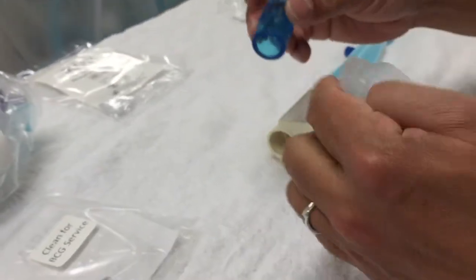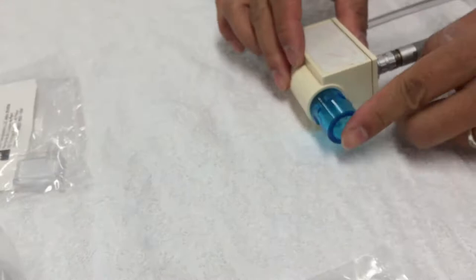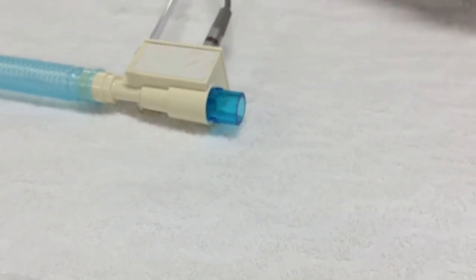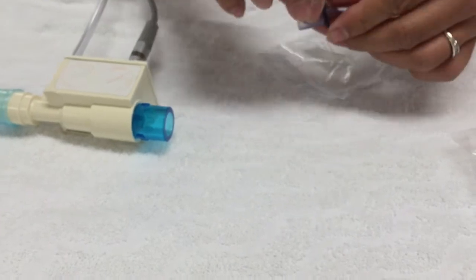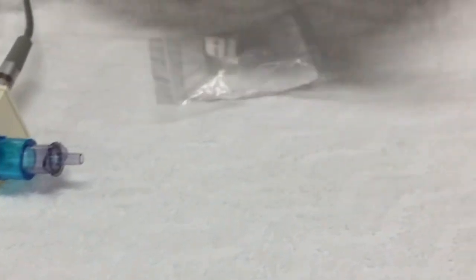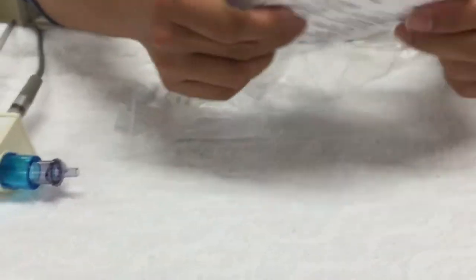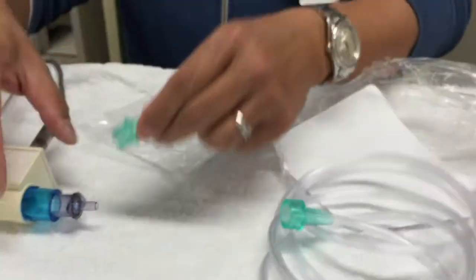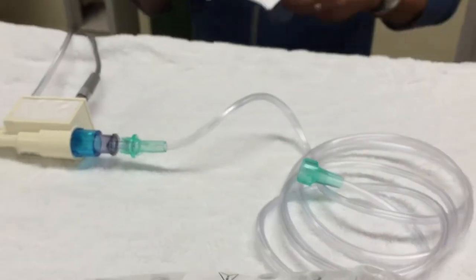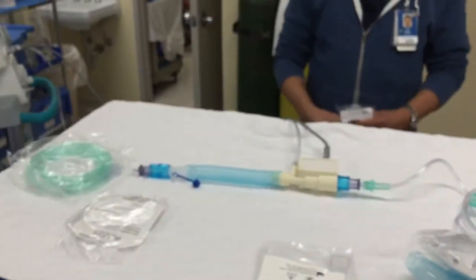Now going backwards — open up your other adapter, goes right there, goes there. And your oxygen tubing goes there. There you go — now you have the whole setup assembled. We'll just go over how the other connectors connect with the machine.